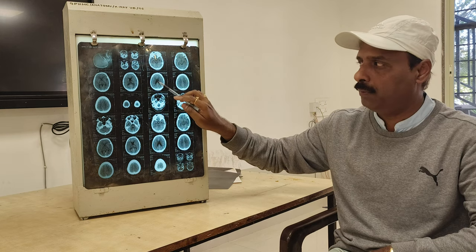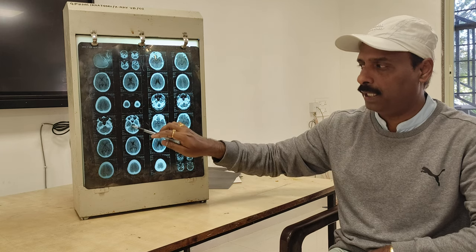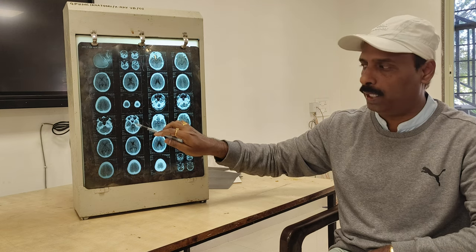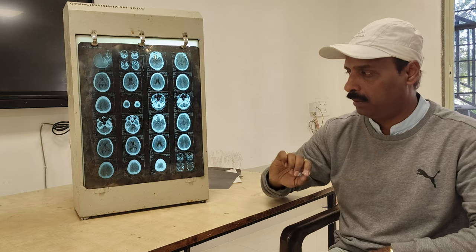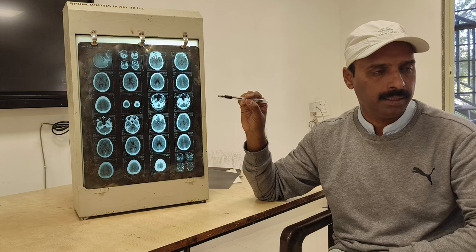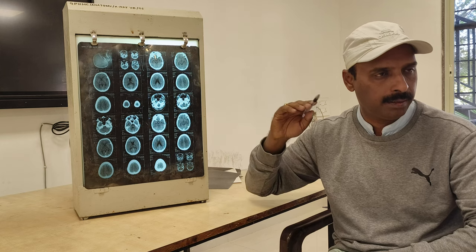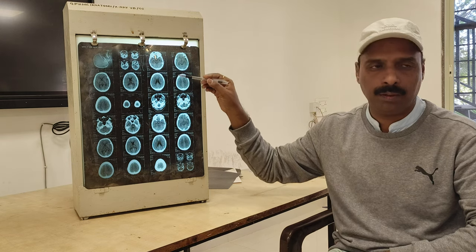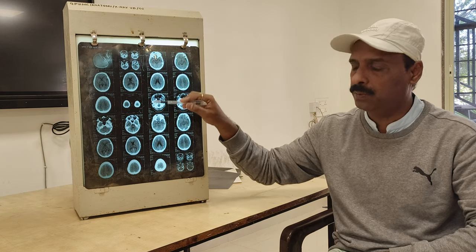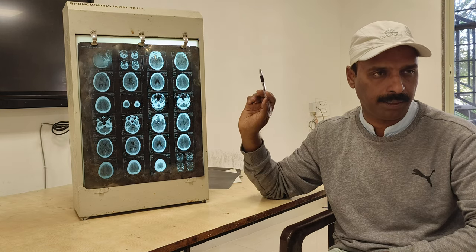At the ventricular level, we are going to get the ventricles. Then at the base of the skull level, you are going to get the optic chiasma, and the sphenoid bone and so on. That is the base region. This is the X-ray we call a CT scan of brain. At the different levels, we take the different X-rays of the brain, and that is a computerized tomography.